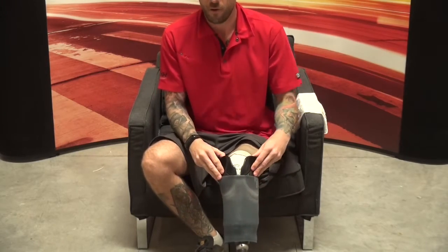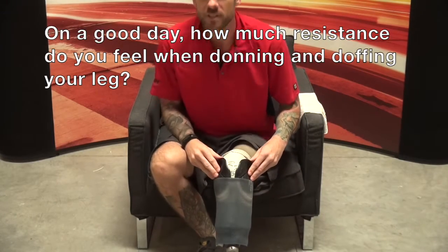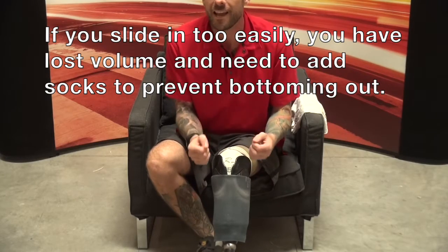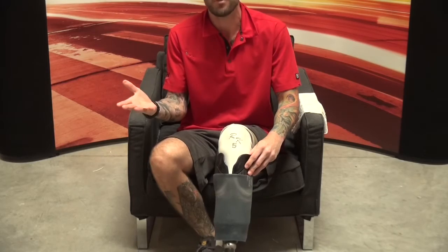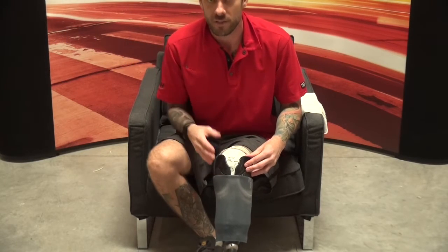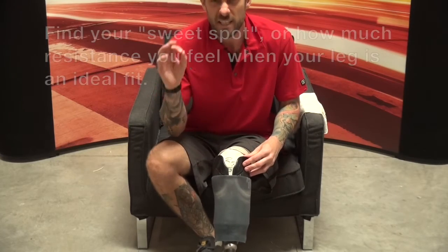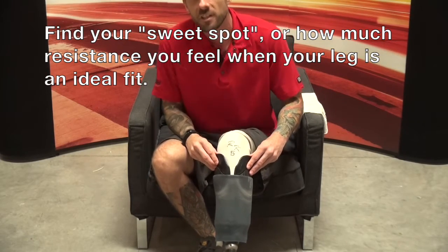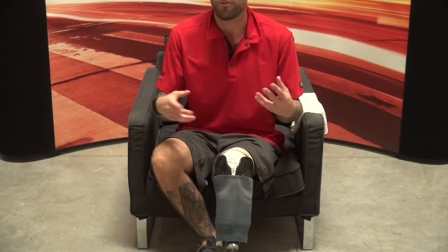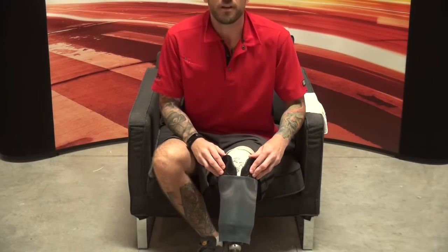When you're having a good fit on a great day and it feels right, here's something to check: when taking your leg on or off, pay attention to the amount of resistance you feel when sliding into and out of your socket. If you slide in really easily, you may have shrunk a little and need to add a sock. If you're fighting to get in and it's squeezing you, you're probably wearing it too tight and need to lose some socks. Pay attention to that sweet spot — that amount of resistance is what you're looking for.